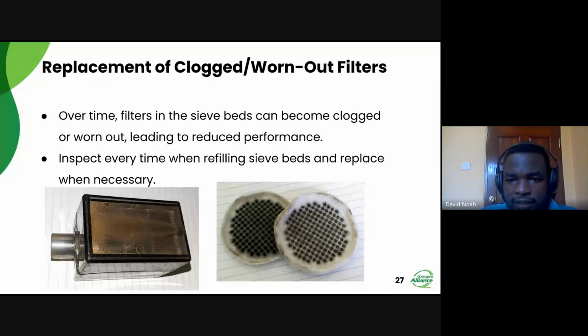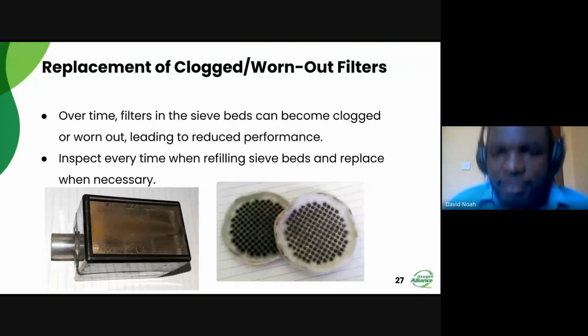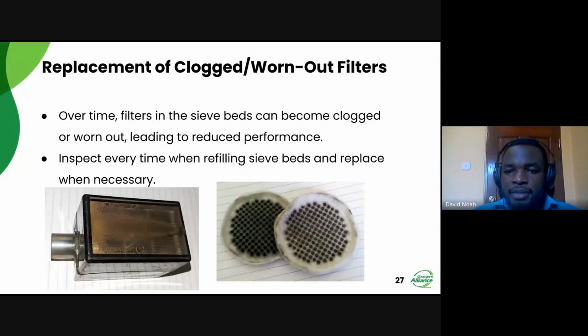So as you can see in the picture to your left, that is a HEPA filter, which has a lot of dust in it. So it is important to inspect every time when refilling sieve beds and, where necessary, replace. So to your right is a picture of a filter which is found in the sieve beds of oxygen concentrators. So it's important every time to inspect when refilling sieve beds and check if it's necessary to replace those filters. So timely replacement of the filters in oxygen concentrators is essential to maintain their efficiency and longevity.